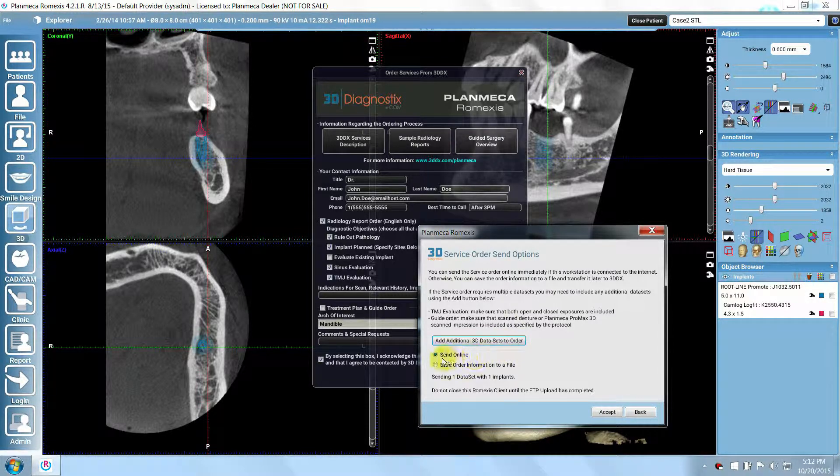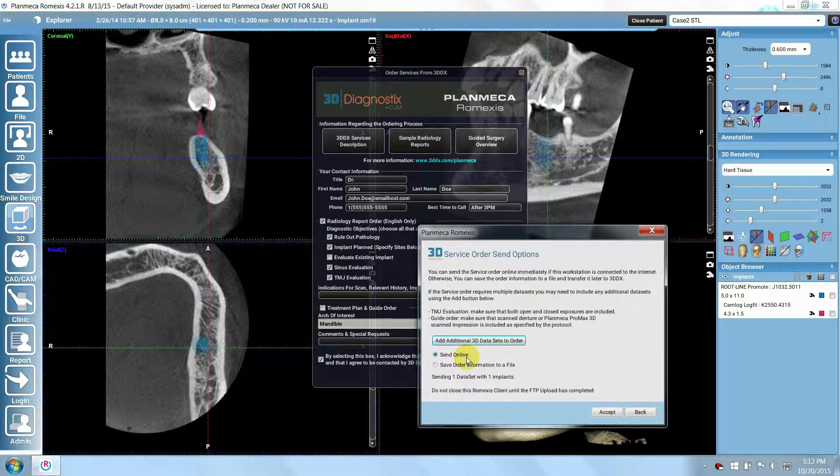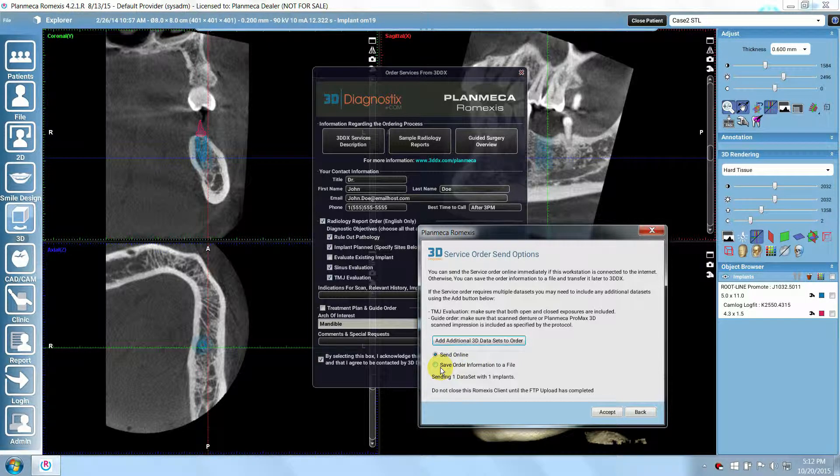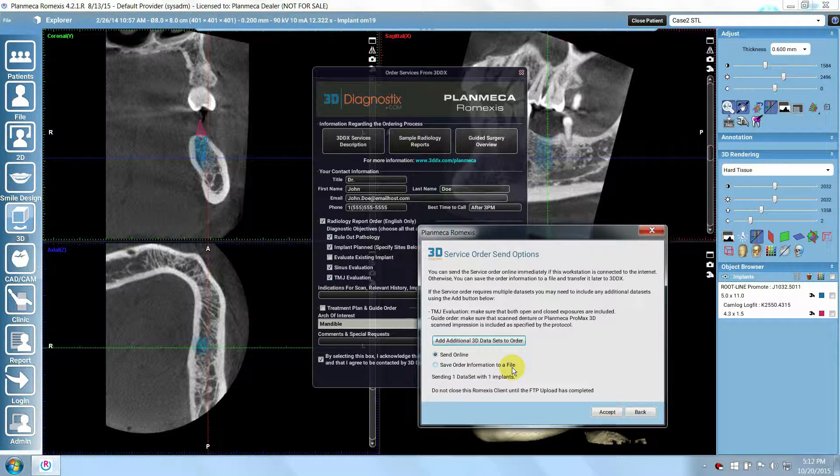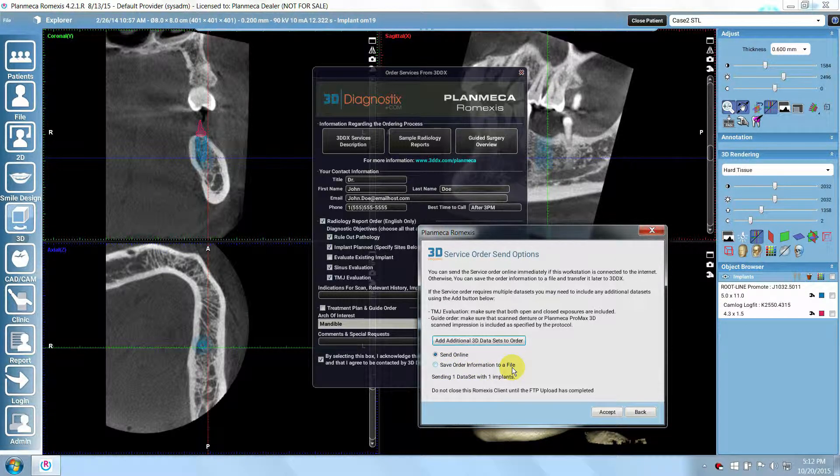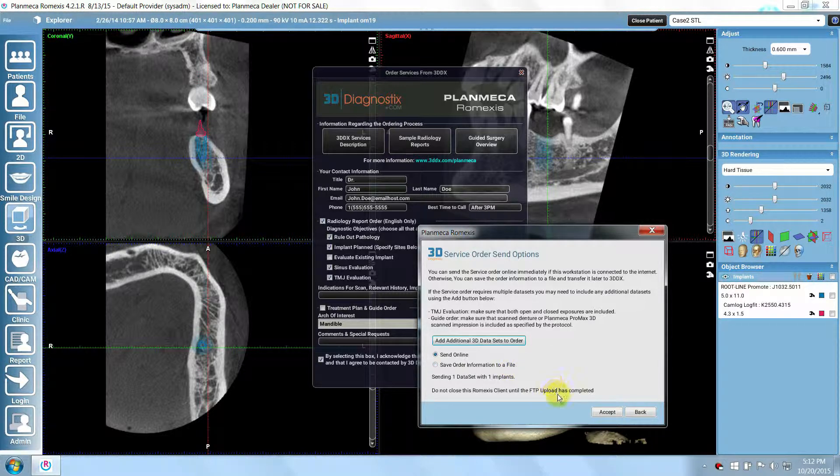Select Send Online to immediately send the case directly from Romexis to 3D-DX, or select Save Order Information to a File if you will be manually sending the case to an FTP site later. Last, click Accept.